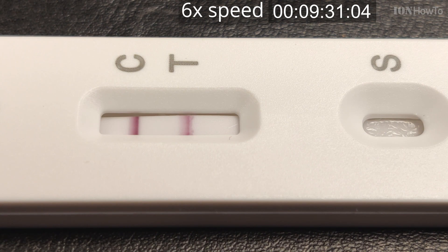It's getting pretty clear that this is a positive test result. The video is now sped up to six times real-time speed, and you can clearly see the positive result.